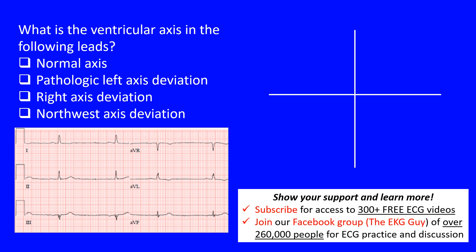Here we have a question that says, what is the ventricular axis in the following leads? These leads down here are the six limb leads on the left side of the standard 12-lead ECG. You can imagine the other precordial leads would sit here: V1, V2, V3, V4, V5, and V6.